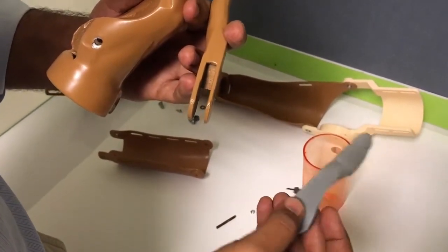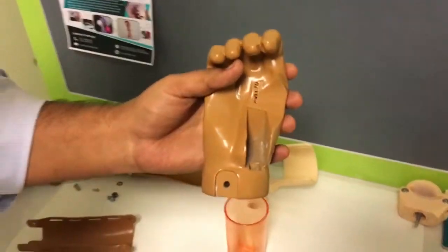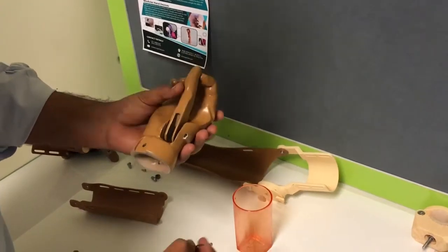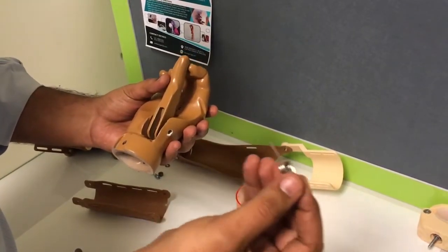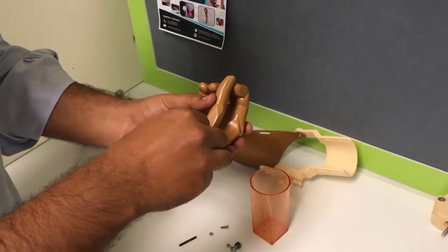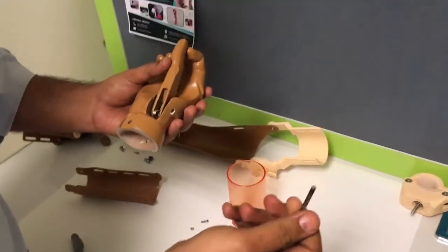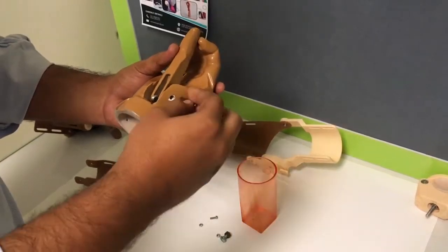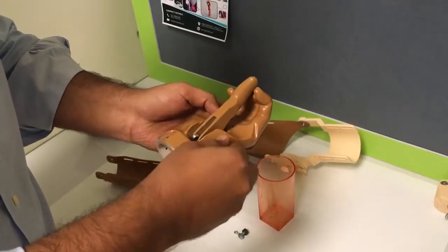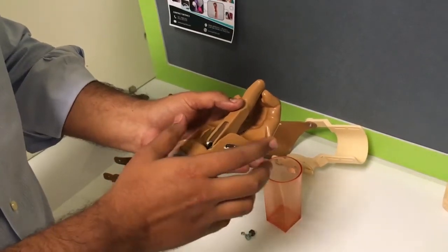We modified the thumb, which you can see over here, as well as the palm. First we insert the thumb over here, and then we use this spring — it is a three-turn spring — and we insert it over here. With this steel pin, 4mm in diameter, we insert it over here, and this is how it works. This was the alteration in the gripper thumb.